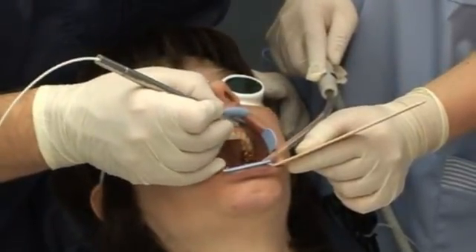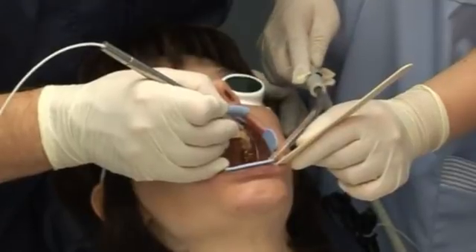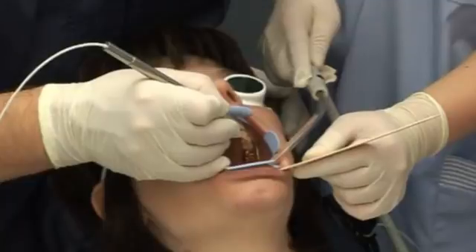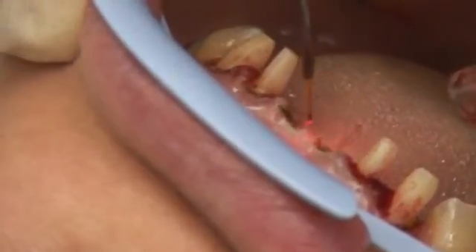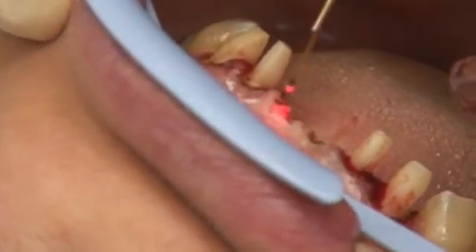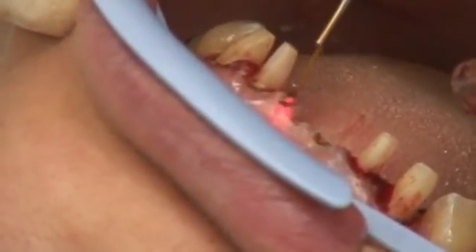With laser therapy, you can take an impression in the same session. The favorable hemostatic effect of the laser means optimal conditions in the operating field, which in turn leads to predictable aesthetic results in soft tissue management.